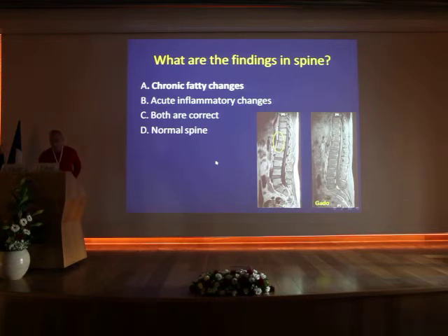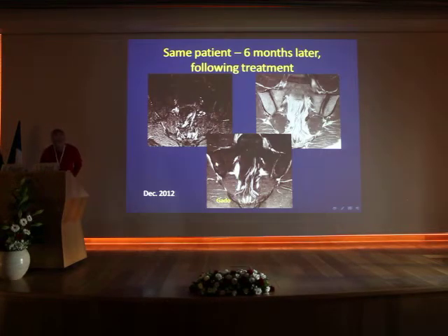But maybe we should point out that when they're doing MRI of the spine, I don't know how you do it in France, but in Israel, mostly the question is disc. Usually you never get the parasagittal parts of the spine. You only get the central. We get everything. We perform coronal slices all the time. So they hardly do coronal, so you miss the enthesis, you miss the facet joints, and we perform sacroiliac joints all together.